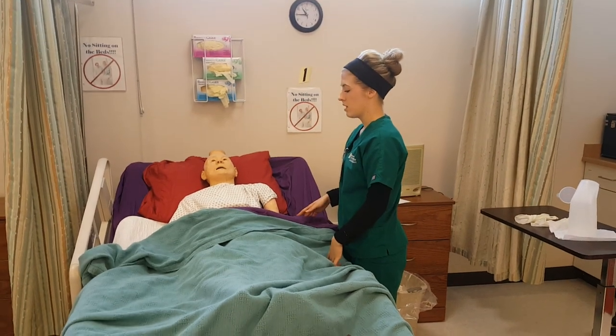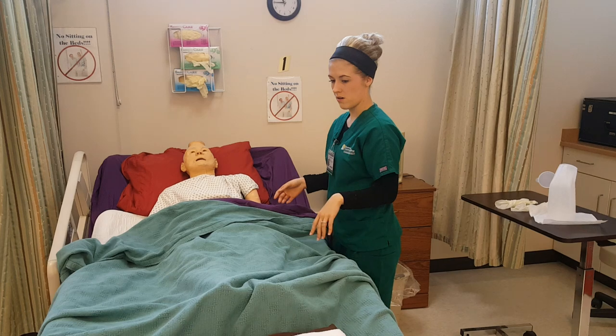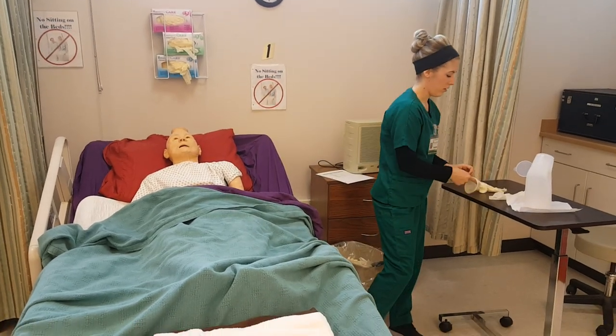Self-identify the patient, explain the procedure, asking if I can use the urinal, and then I would wash my hands and put on clean gloves.